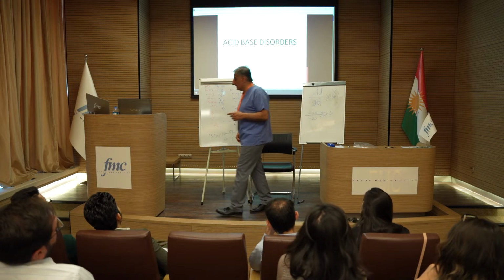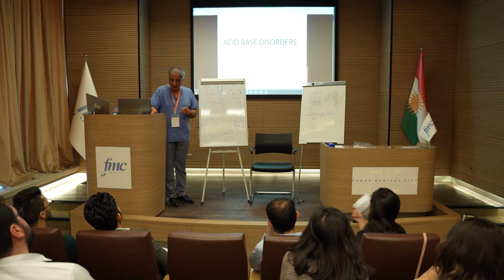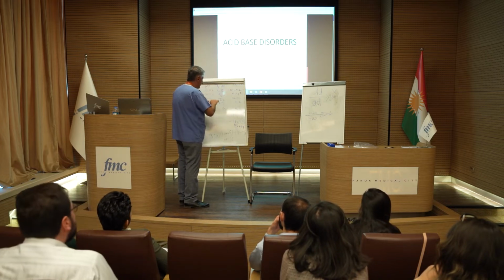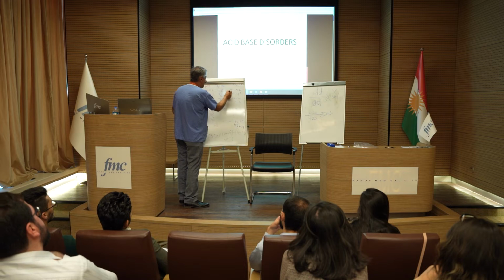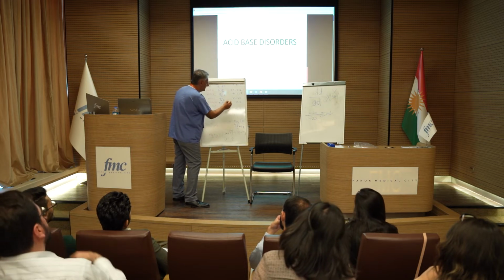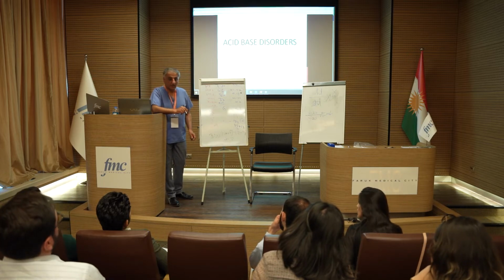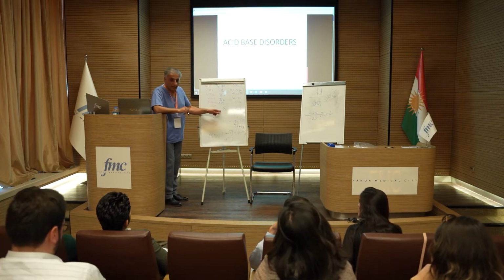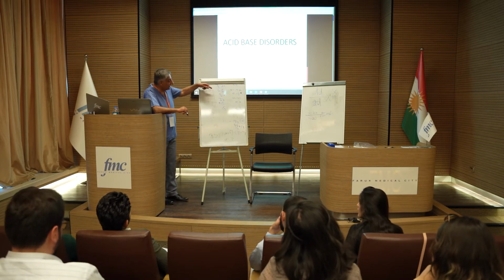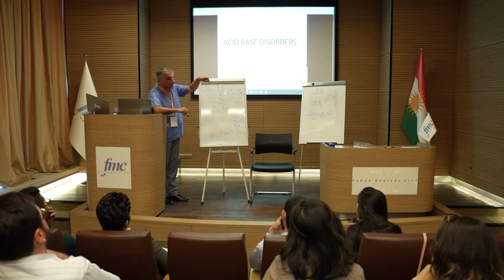In fact, this lady's normal CO2 is 8, and her normal bicarbonate is 40. So now my thinking has changed because of the lactate. I think it's metabolic acidosis, and she's compensating by hyperventilating, washing the CO2 from 8 to 6.8.